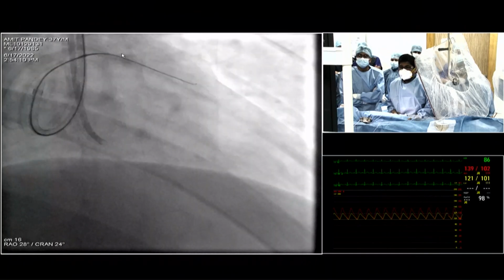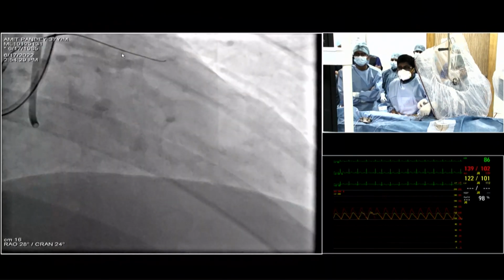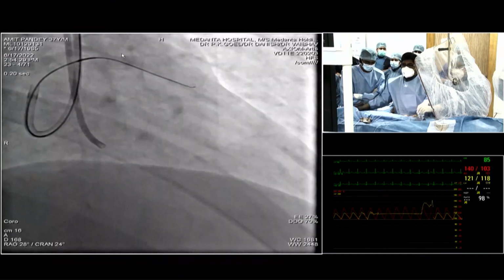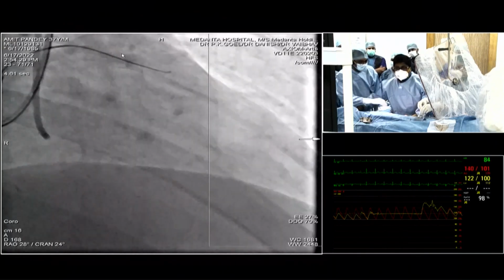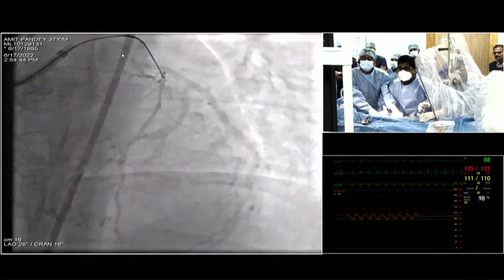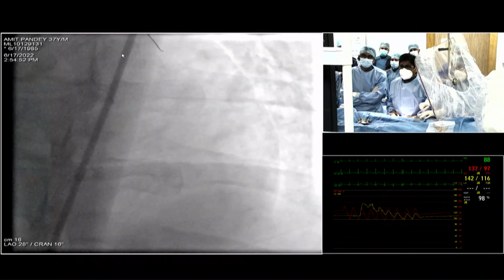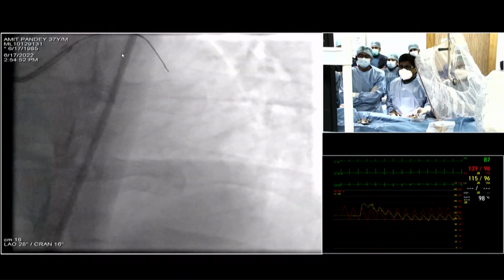Just a sec. He just wanted us to give a minute for him to work, and then he said he would tell us what has gone on. Right injection, please. You see, I'm trying to redirect it. What wire do you have? Gaia 2. You have a Gaia second, all right? Did you do a parallel wire at all, or did you just switch to another wire? Maybe one more caudal view also, then you find out for caudal views.